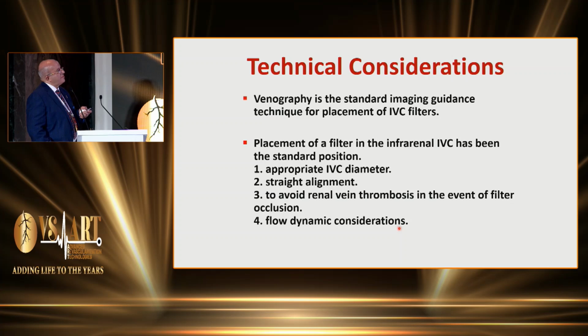Technical consideration: venography is very important as an imaging guidance technique for placement of the IVC filter. Placement of the filter in the infrarenal IVC has been the standard position, with appropriate IVC diameter, straight alignment to avoid renal vein thrombosis, and flow dynamic consideration.